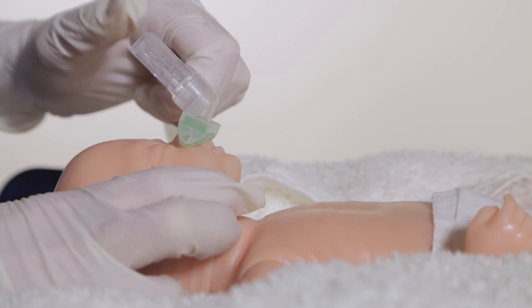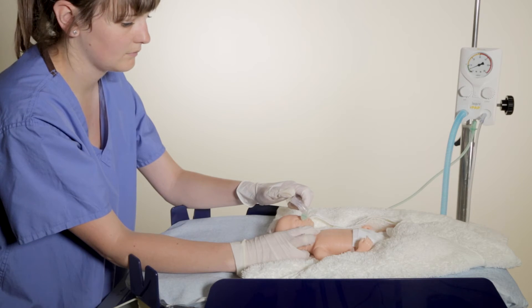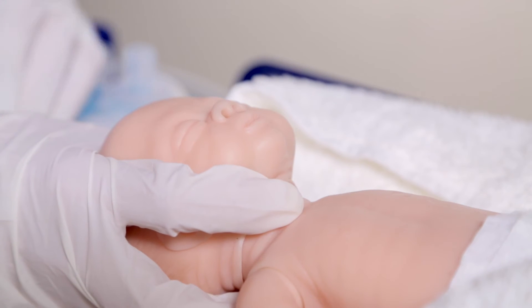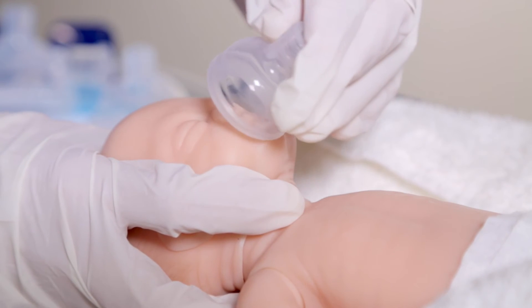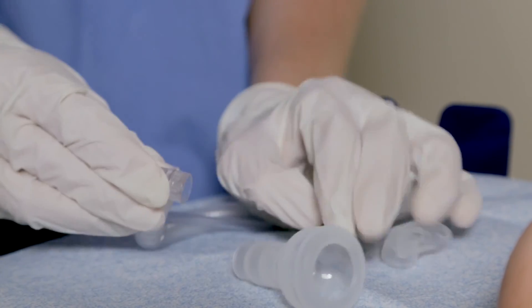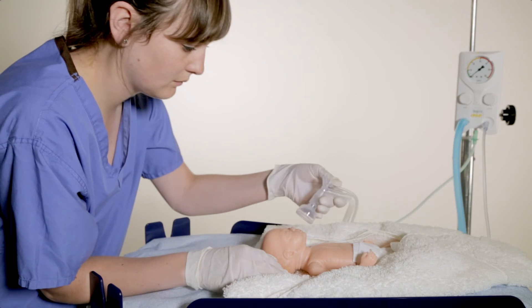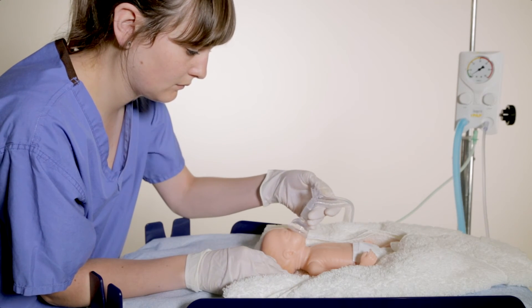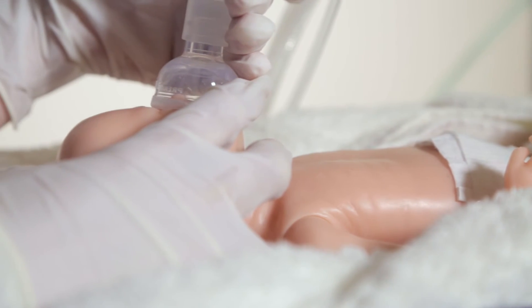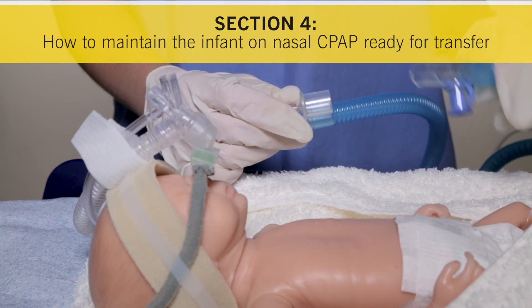Resuscitate by placing and removing your finger over the gas outlet to trigger inspiration and expiration. Alternatively, if performing face mask resuscitation, select the appropriate size face mask for the infant and attach it to the mask adapter. Remove the nasal prong adapter and replace with the mask adapter. When ready to begin resuscitation, place the face mask over the infant's nose and mouth and resuscitate by placing and removing your finger over the gas outlet to trigger inspiration and expiration.